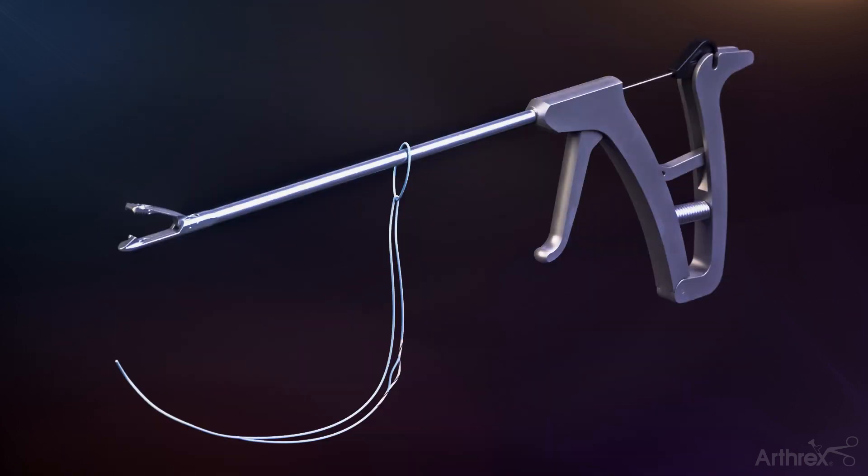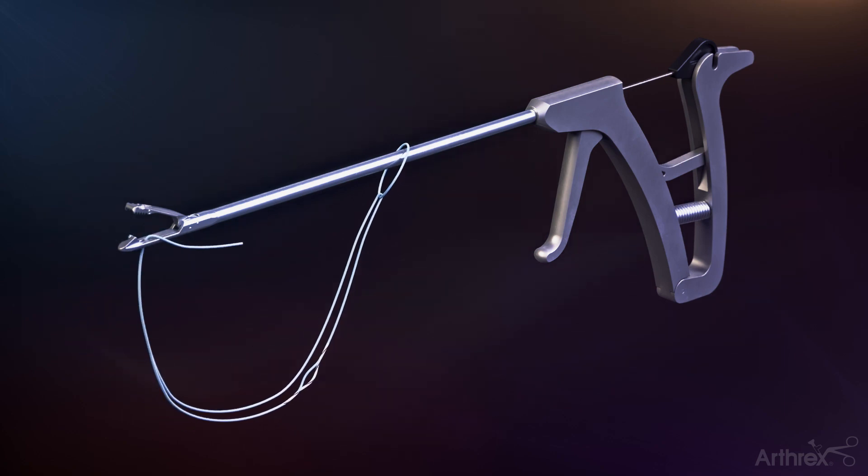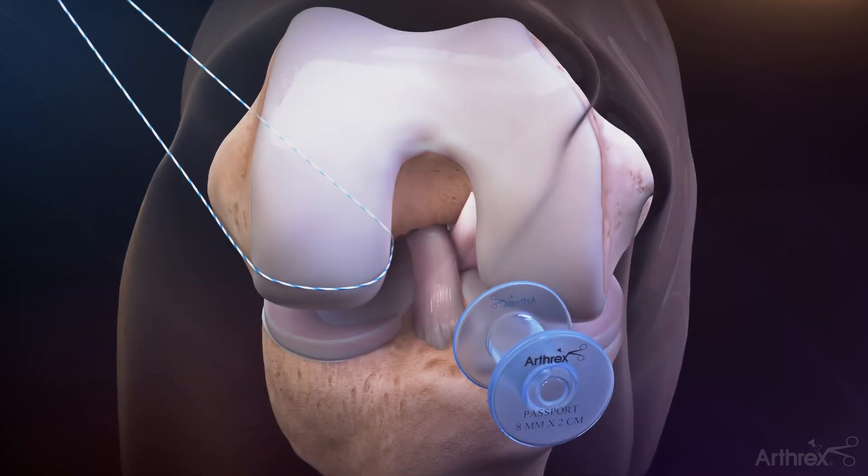Pass the small ring portion of the fiber ring over the tip of a fast pass scorpion suture passer. Load the single end of the fiber ring suture into the scorpion. From the medial portal, pass the fiber ring through the intact remnant of the avulsed ACL. Gently pull the end of the shuttle loop to cinch down the fiber ring, forming the luggage tag stitch.